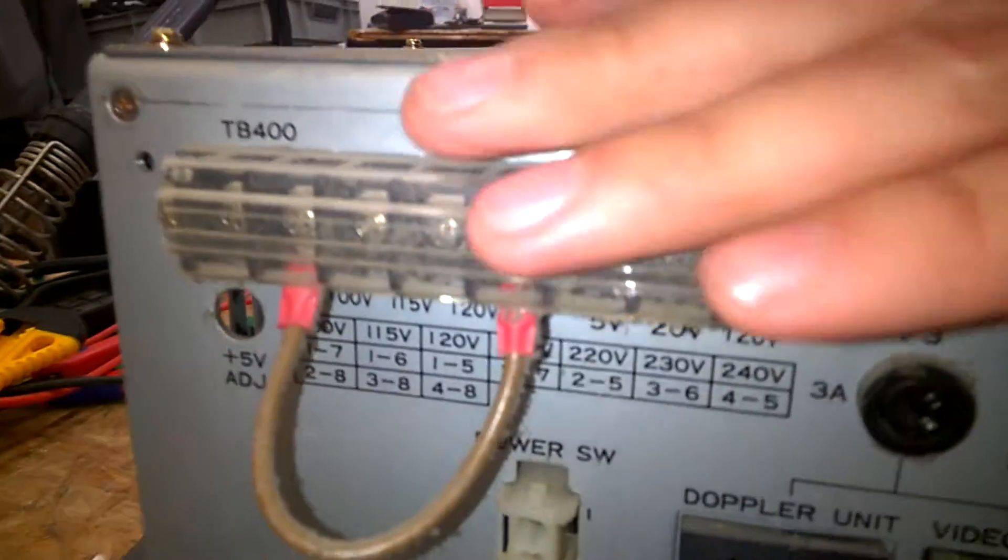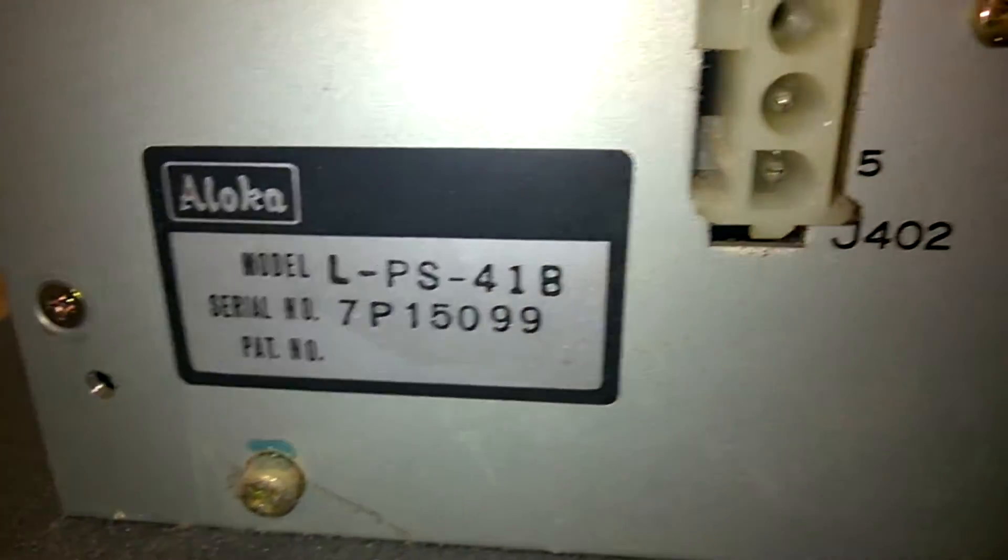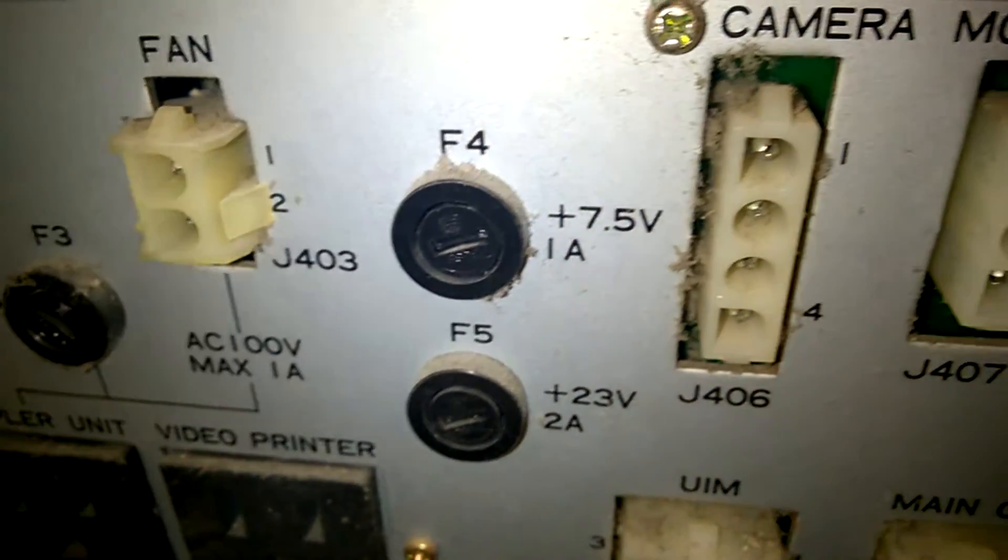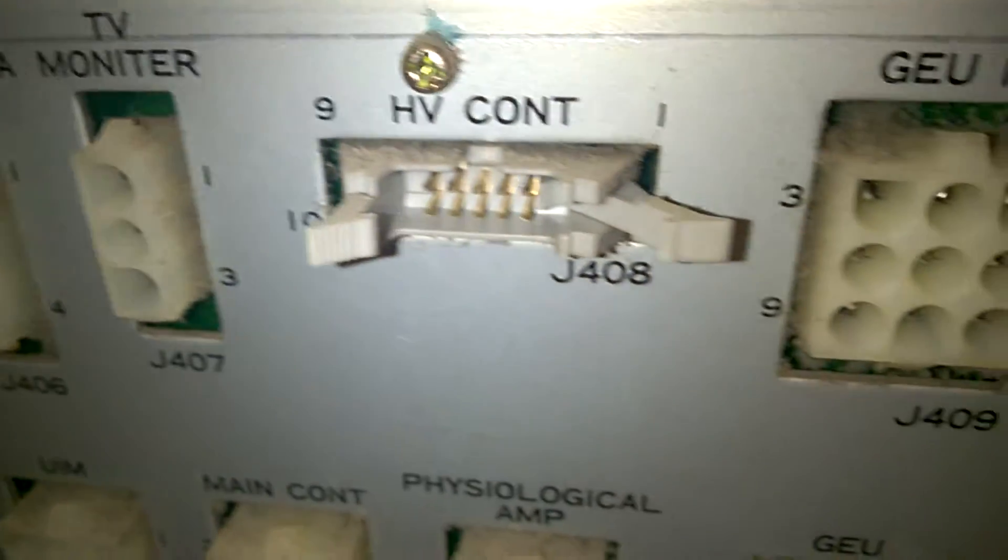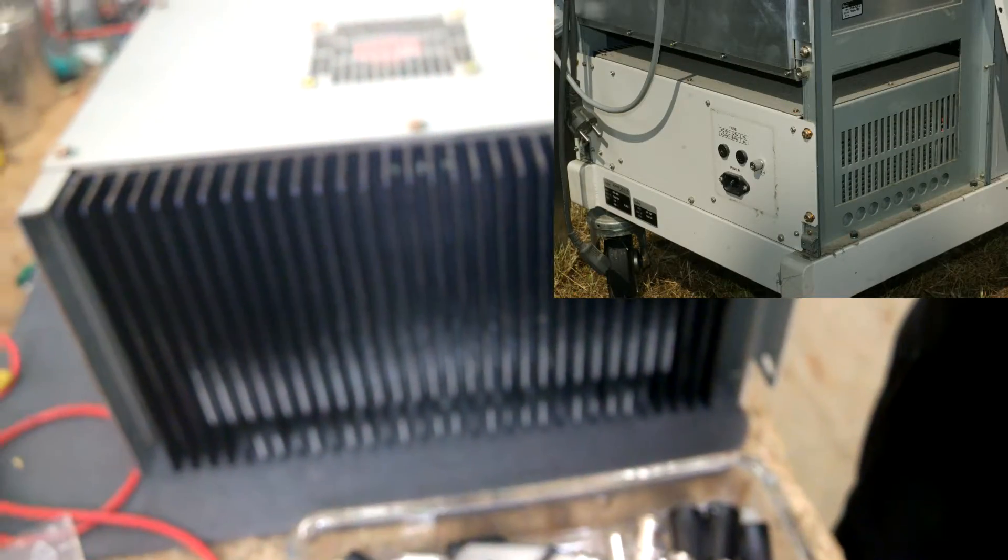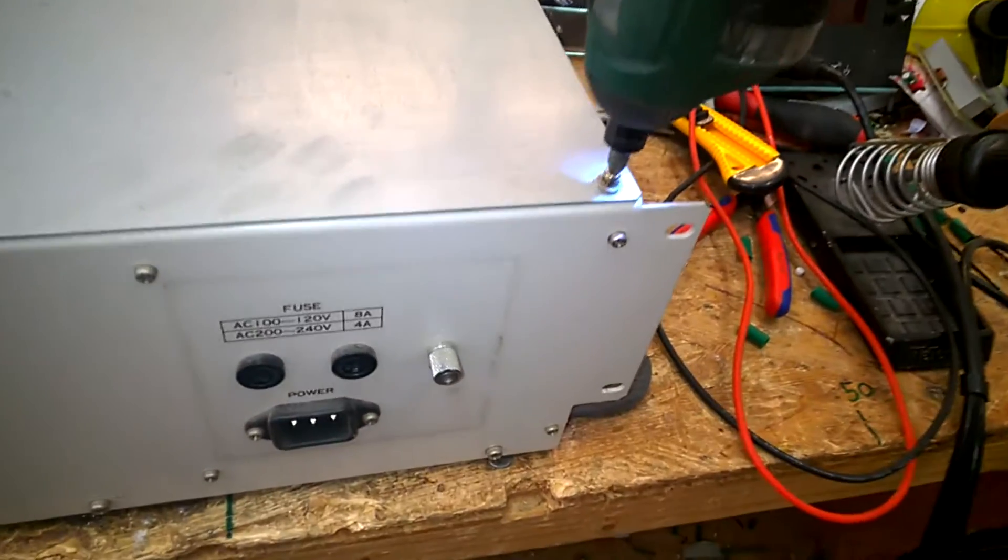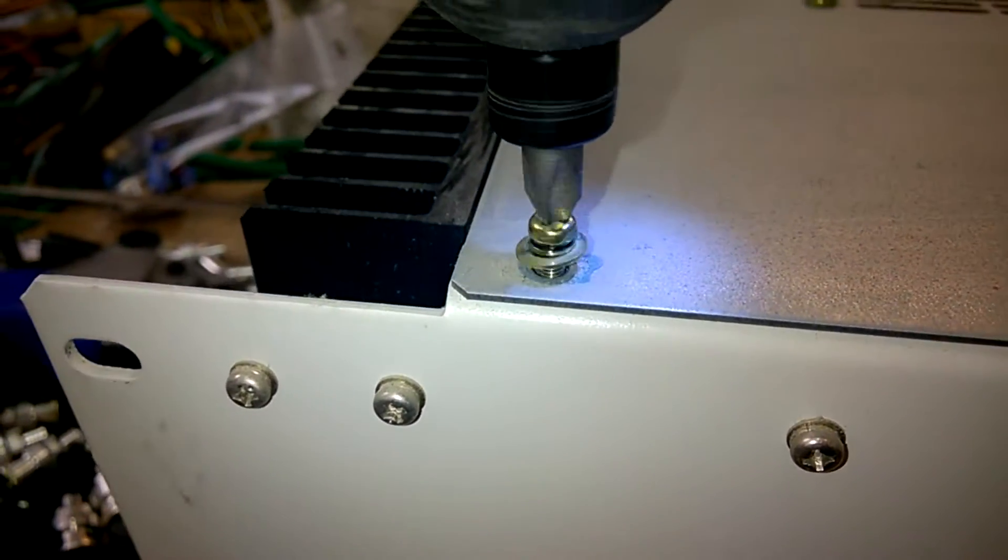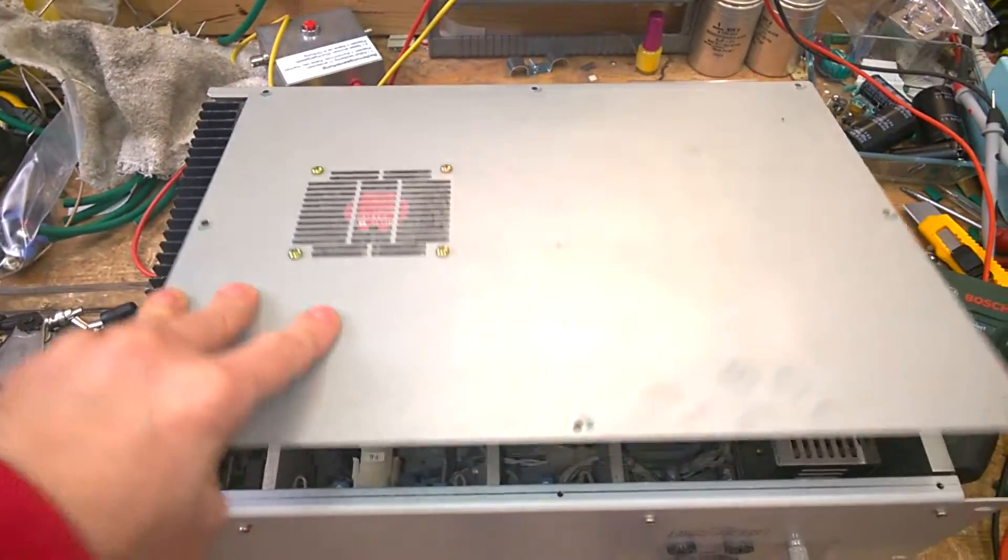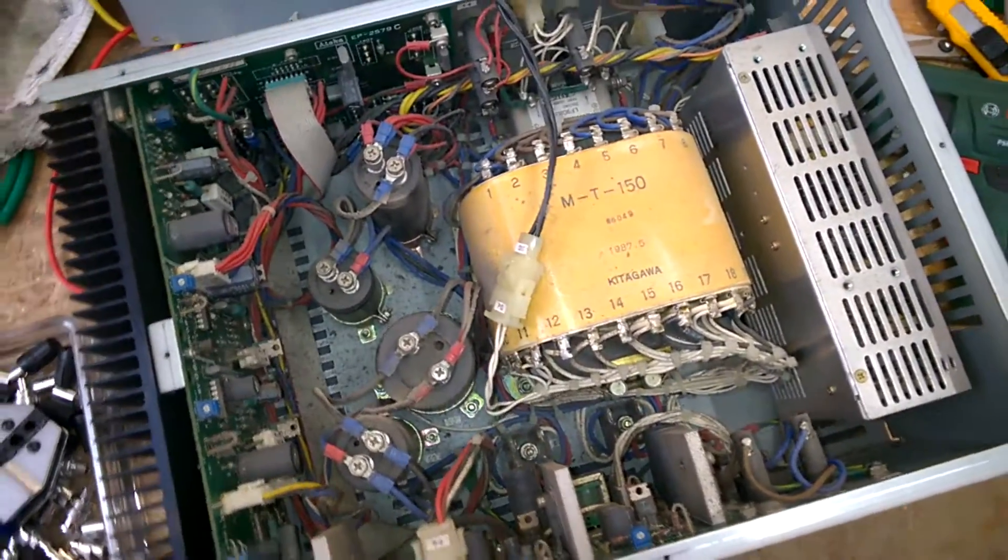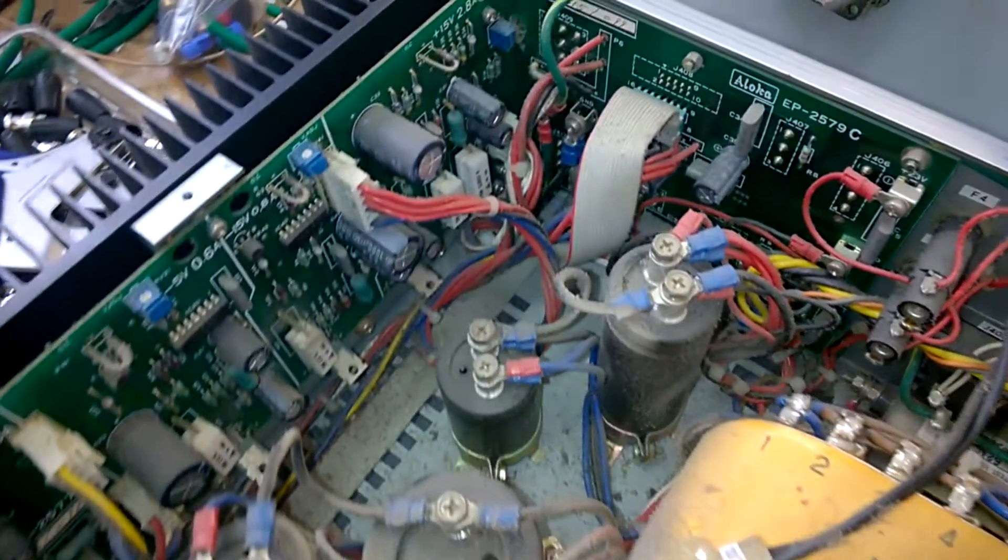So, here are the power inputs, here is the serial and the outputs. Let's have a look inside. I'm loving it. Beautiful.